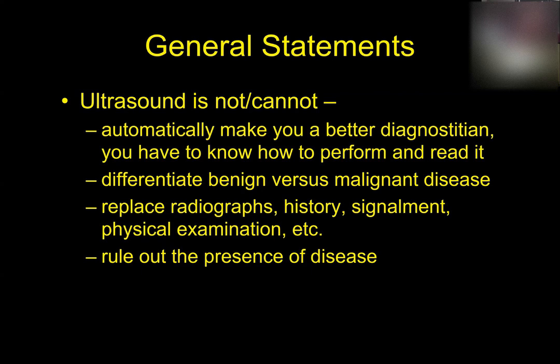Just because you have ultrasound doesn't mean you will never shoot another radiograph. We talked about before that radiographs and ultrasound are complementary procedures. You see things on radiographs you will not see on ultrasound, and the vice versa is true. You see things on ultrasound that you do not see on radiographs. It will also not replace common sense things like being a good doctor, doing the right thing, getting a good history, and keeping in mind the signalment of the animal.